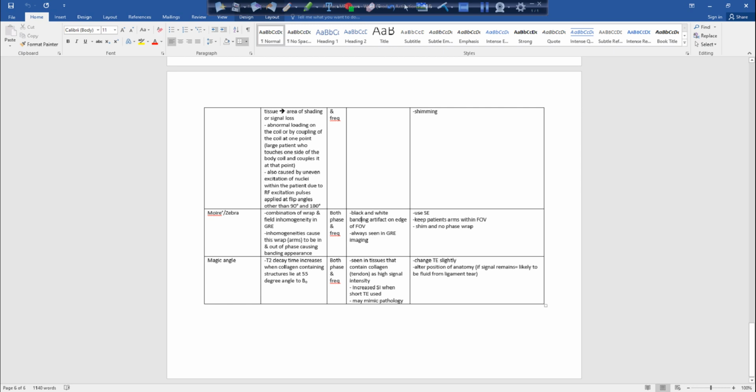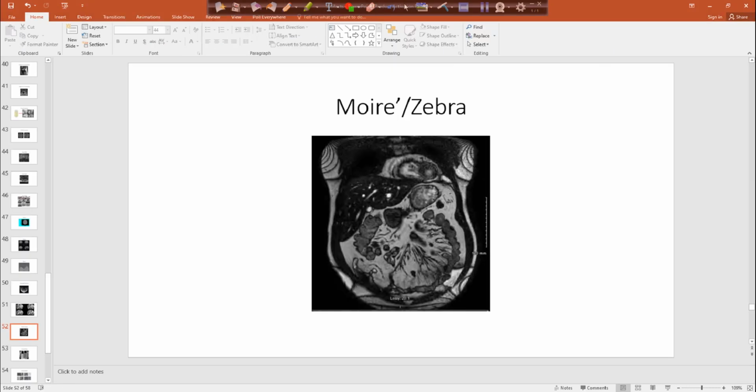And you know, sometimes we just do this coronal of the abdomen just to set up our slices for our axials, right? So are we really concerned with eliminating that artifact? No, because it's almost like another localizer scan. The radiologist will look at it because they might find an incidental finding like in the heart or something, but you're really just setting your slices up for the coming scans. So then you get above the liver all the way down to below the kidneys.